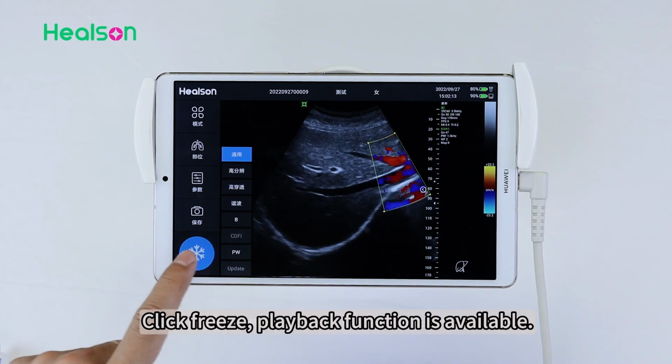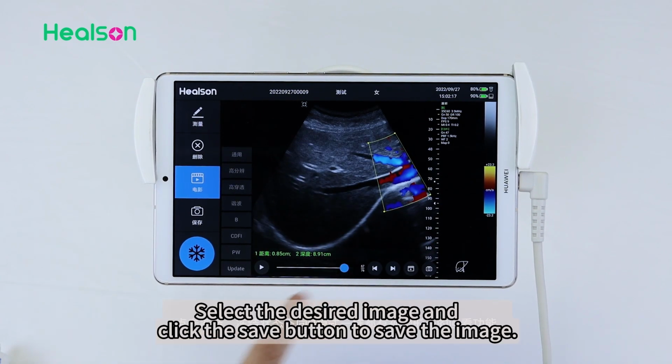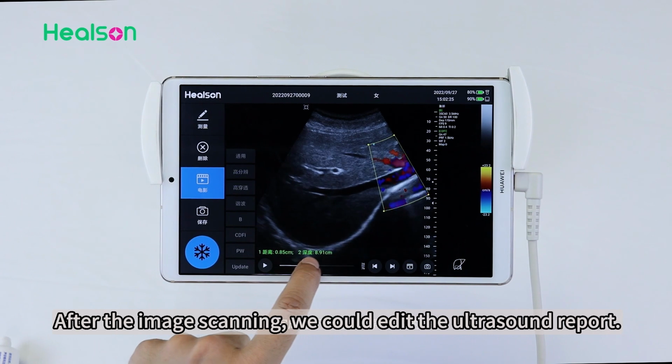Click freeze, playback function is available. Select the desired image and click the Save button to save the image. After the image scanning, we could edit the ultrasound report.